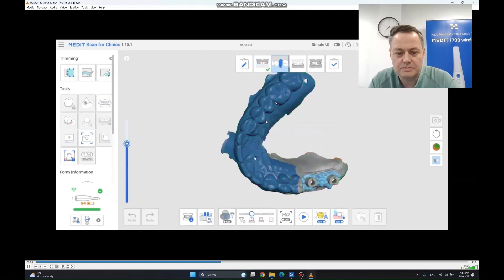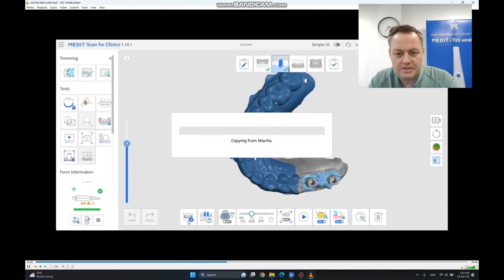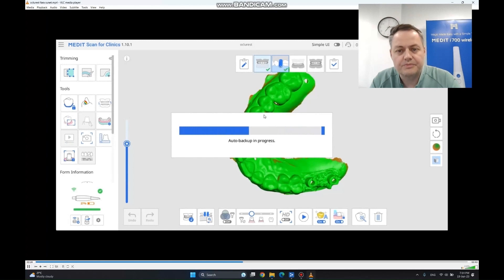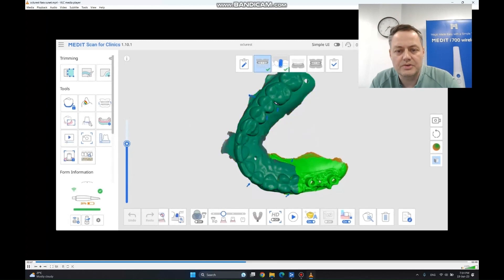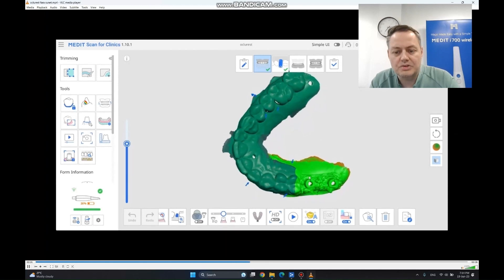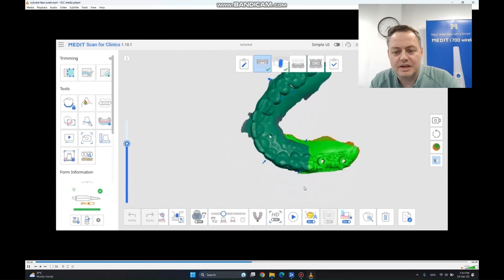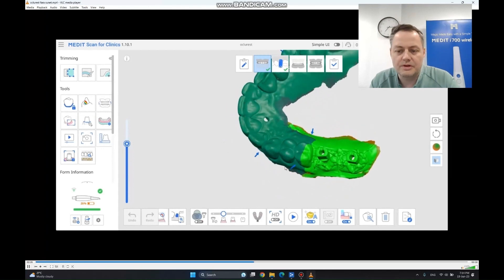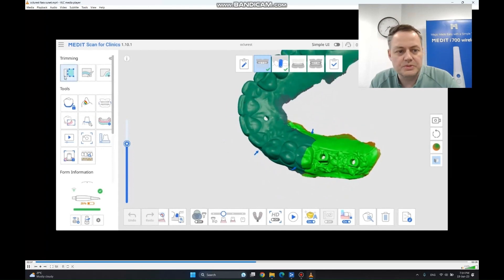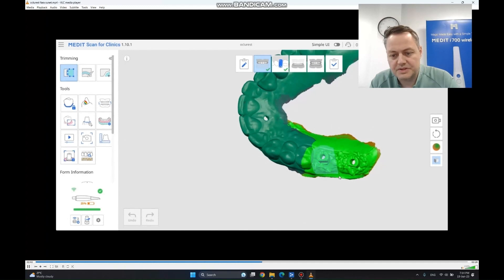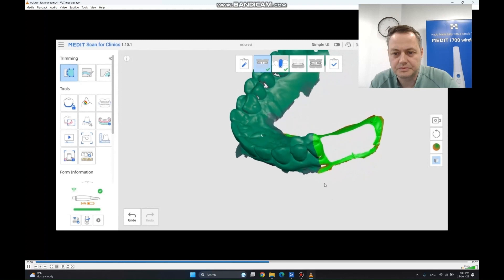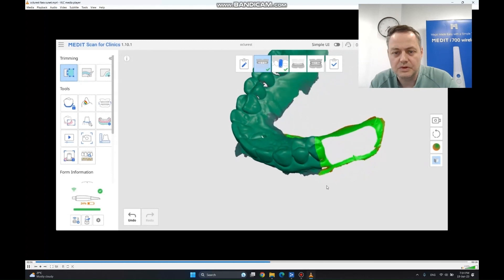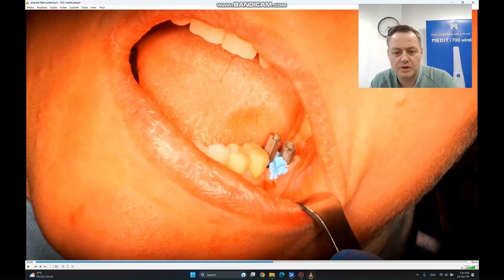We are copying the maxilla in the scan body stage. And now that we copied it, we are going to go back to the maxilla and cut out the scan bodies as we did before and the material being used in between them. As you can see here, I am not going to cut too much away, in fact as little as possible. This is done. We are going to block everything.